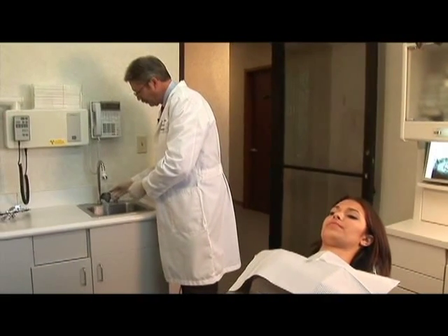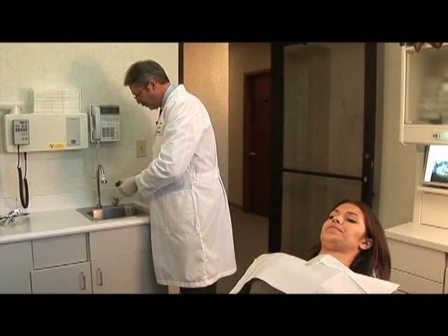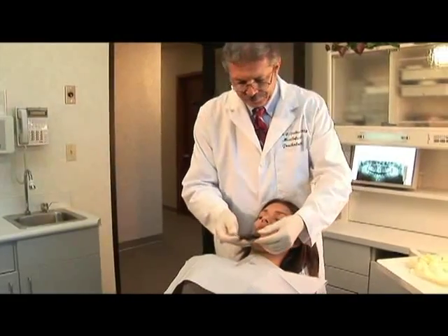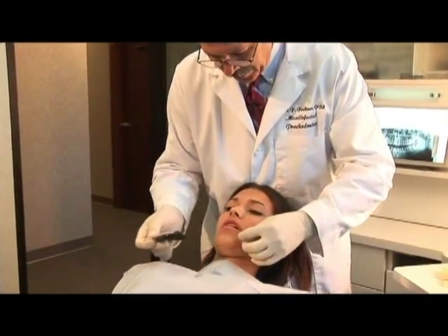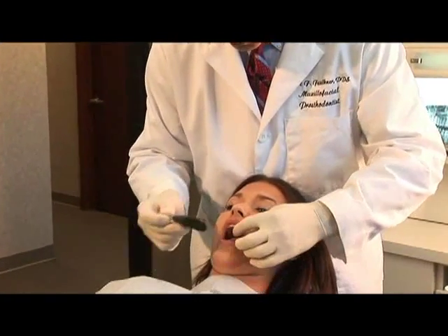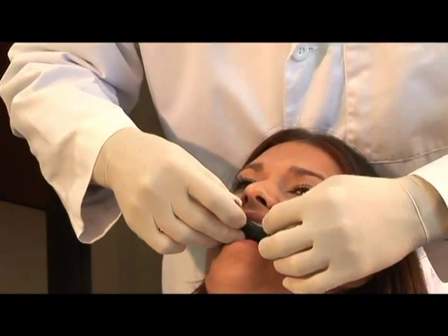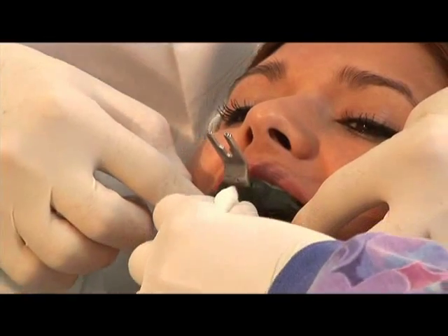Rinse the impression compound under cold water. Inspect the registration for any soft tissue or deep occlusal registrations. Any excess can be trimmed away with a Bard-Parker blade. Place the bite fork back into the mouth. Ensure the cusp tips seat all the way into the registration record.